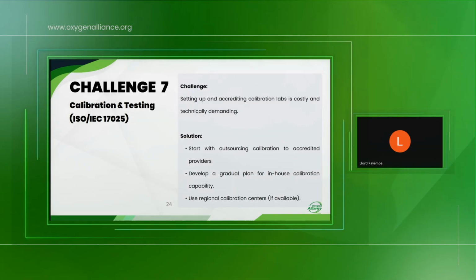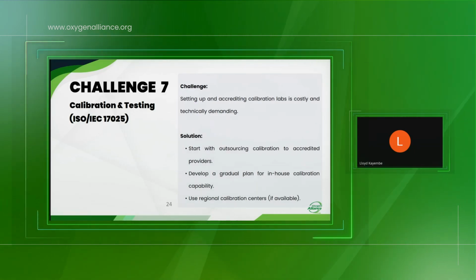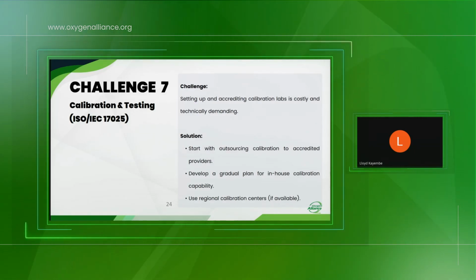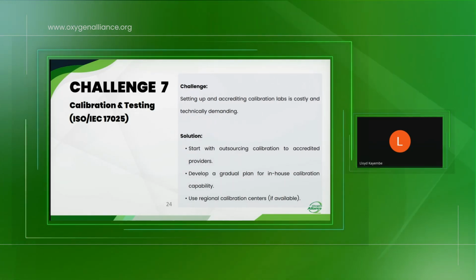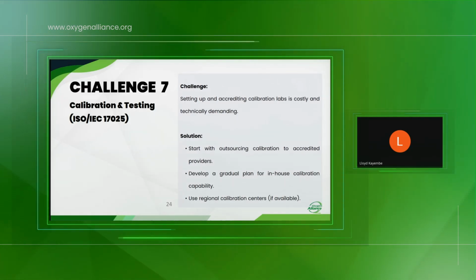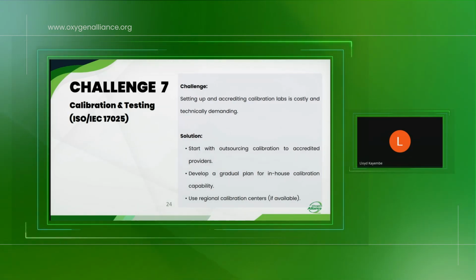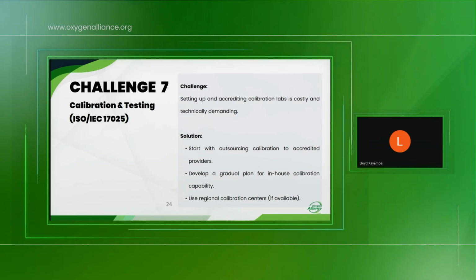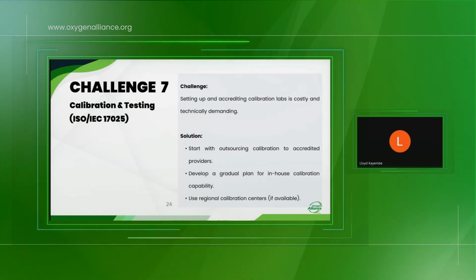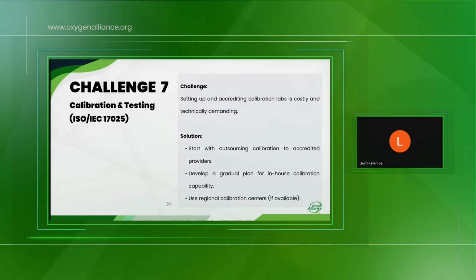So the LIMS is much more focused around that, while the computerized maintenance management system is more about the medical equipment itself, like managing the maintenance scheduling of those equipments, asset tracking, even work order management to reduce downtime of an equipment. So they are actually different systems. Yeah, that's what I would add.